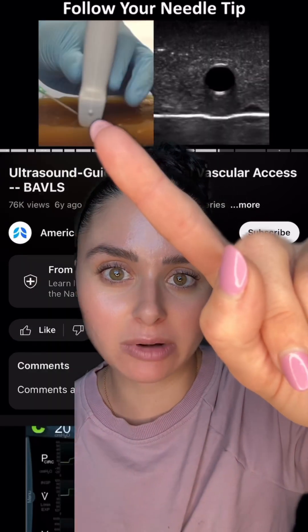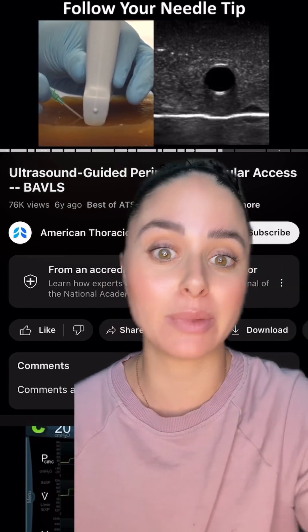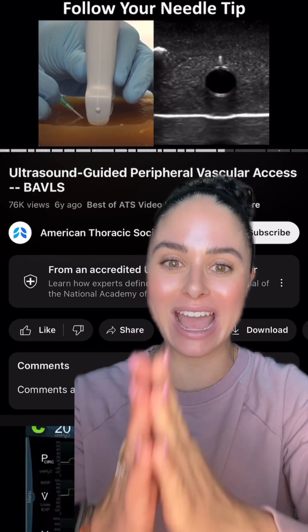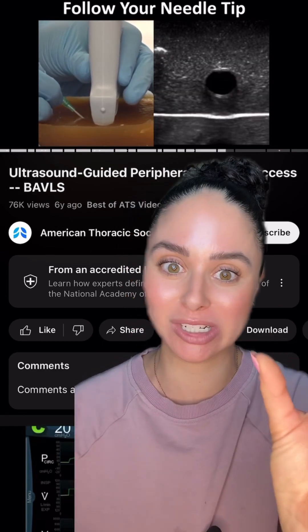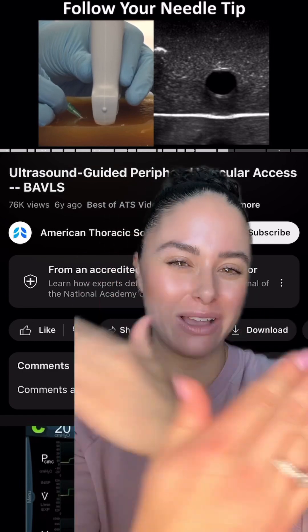You can also see this little dot on the ultrasound — sometimes it's on the other side — but that little dot needs to face the patient's right side. This ensures that anatomy-wise you are lined up correctly, so if you're moving the ultrasound to the right you're viewing things to the right, and not vice versa.